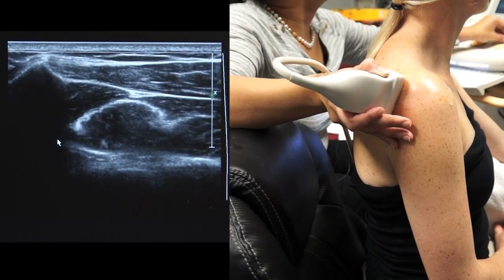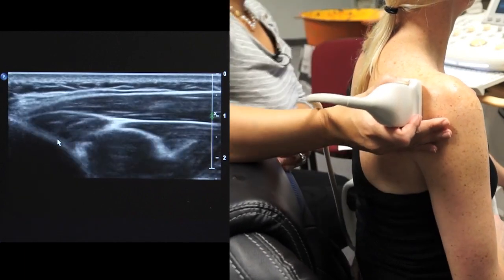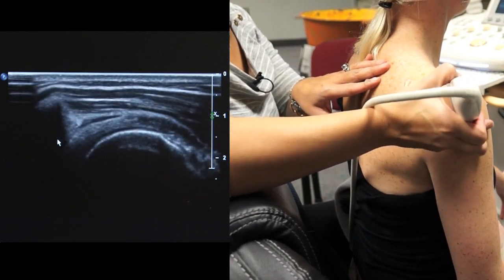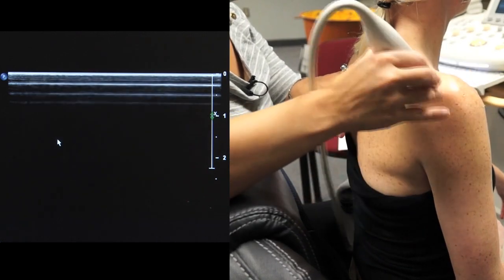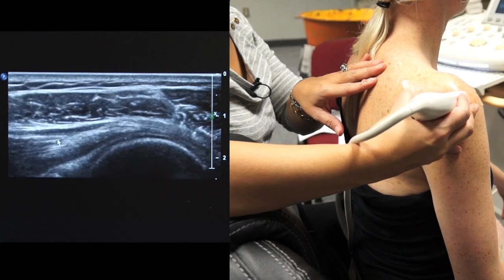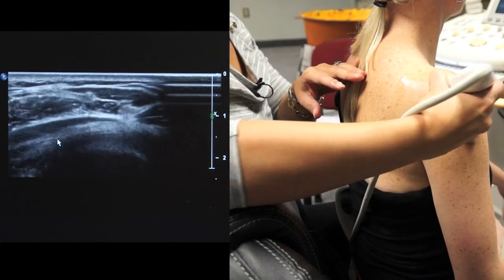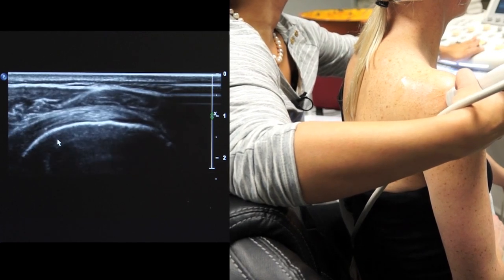I'm going to adjust my depth now. And I'm going to show you how I'm going to slide the transducer towards the insertion. I'm going to follow the tendons, and when I isolate those tendons, I will again turn with the transducer 90 degrees. Now the marker is at the 9 o'clock position, and I can follow the infraspinatus towards its insertion on the greater tuberosity.